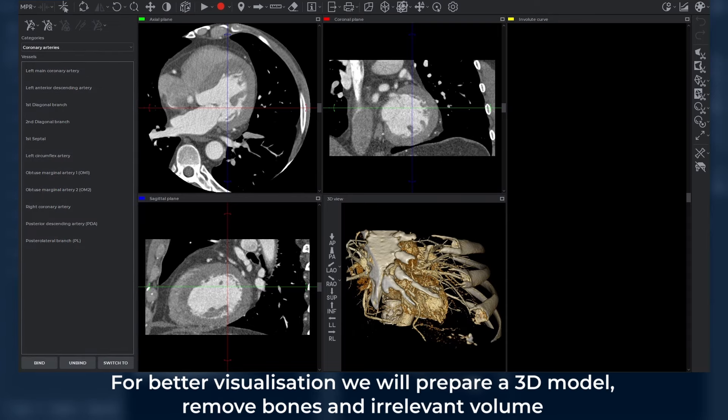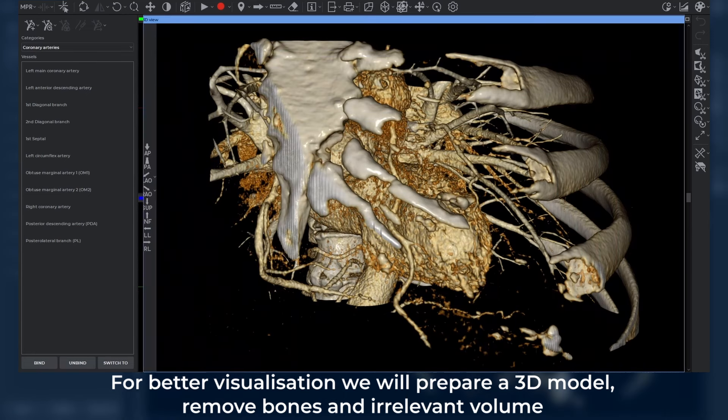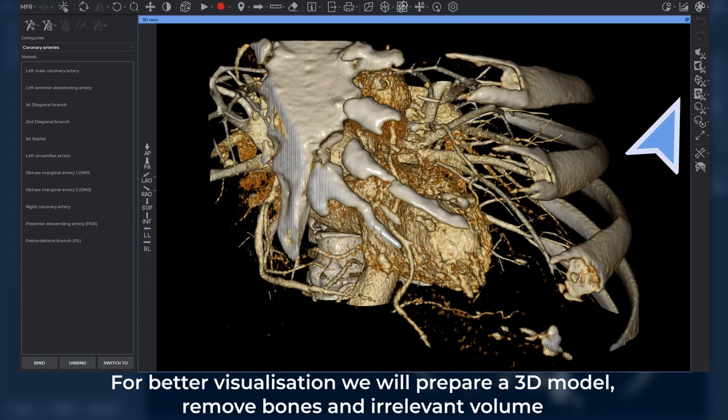For better visualization, we will prepare a 3D model, remove bones, and irrelevant volume.